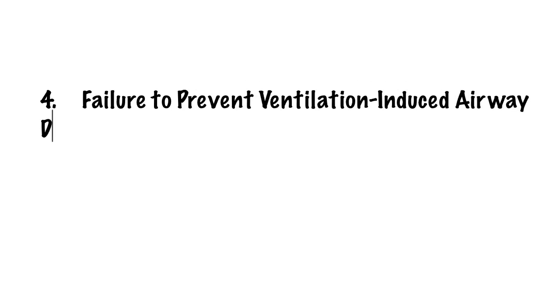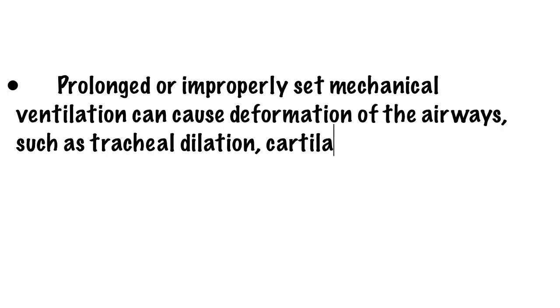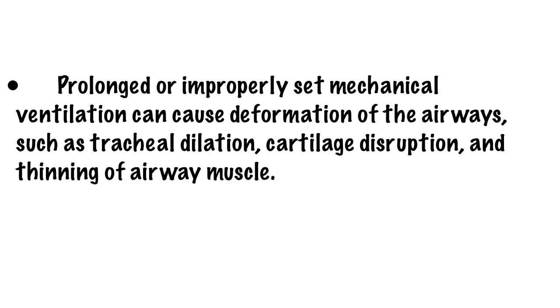4. Failure to prevent ventilation-induced airway damage. Prolonged or improperly set mechanical ventilation can cause deformation of the airways, such as tracheal dilation, cartilage disruption, and thinning of airway muscle.